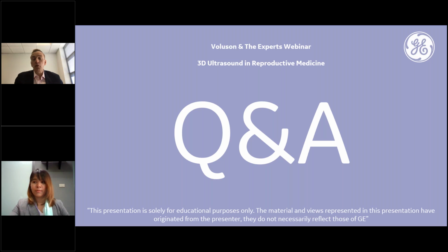I think that if you look at the criteria for adenomyosis, without doubt, well, I say without doubt, I would be pretty confident the most important one is disrupted myometrial endometrial border. That for me is where most of the data comes from. It gives you the most diagnostic confidence. It's got the most similarity with what you find histologically. So you'll often find a myometrial cyst that you're describing here, all these echogenic lesions with an intact junctional zone. I think they're just benign pathology.